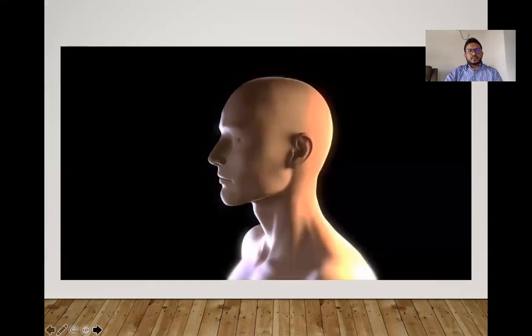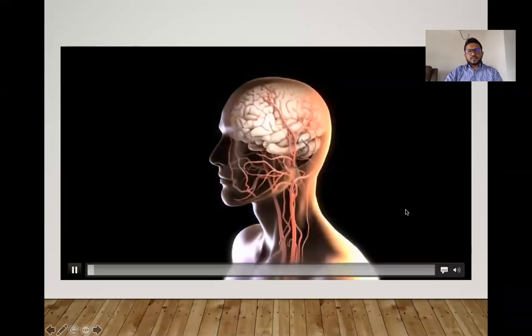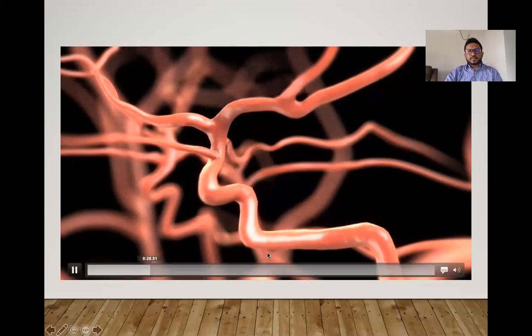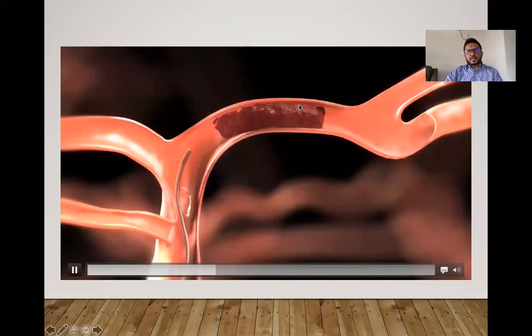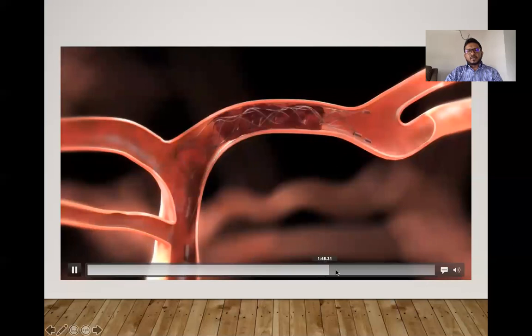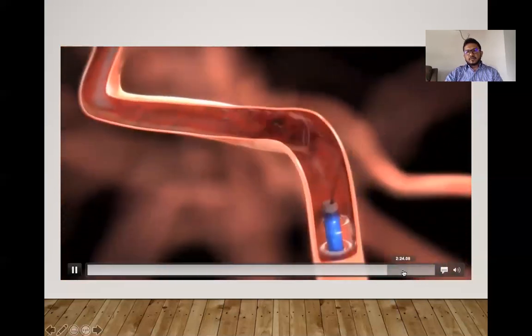There are a few ways of doing it, but basically what we do is a non-contrast CT on presentation, and ideally we would have done a CT cerebral angiogram to locate where the thrombus is. Then we put in a guide catheter, and through that we put a small wire through the lesion, cross the thrombus and expand a stent across it and let it settle for a while. Then you drag everything out, and most of the time you can take out the clot completely, improving the circulation and saving a lot of brain tissue and disability for the patient.